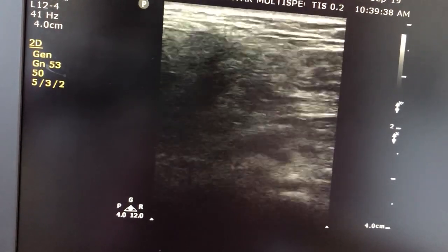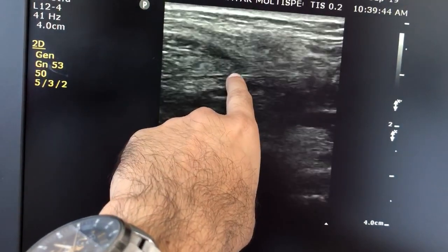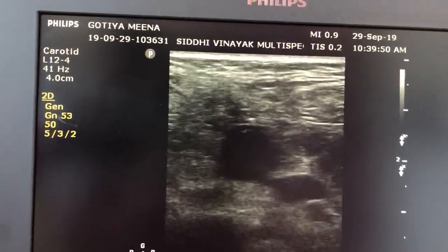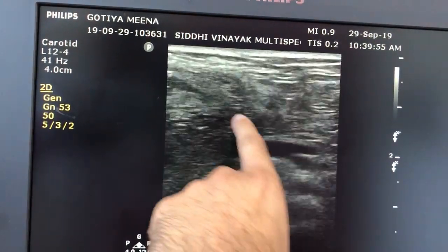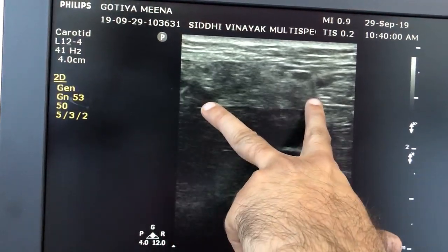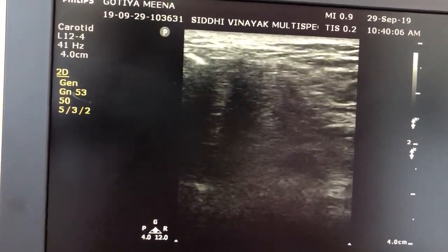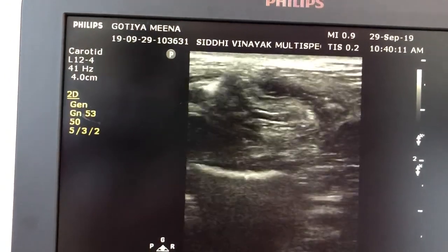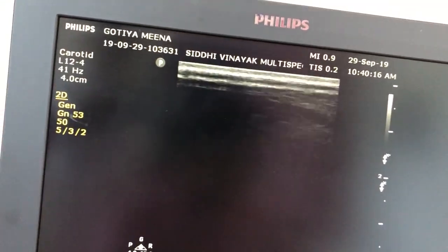And still, if we go downward, this is the rectus muscle ending over here at the medial margin, medial border, and there is no linea alba in between. This is the second rectus muscle, and there is a gap in between, and you can see peristalsis here. The gap is very wide, maybe around 2 centimeters. Further inferiorly, if we go, still the linea alba is not seen.